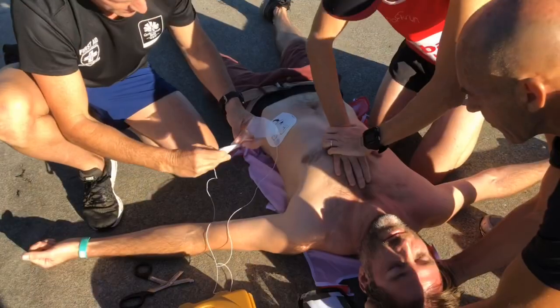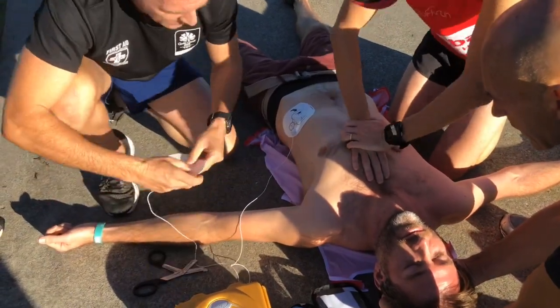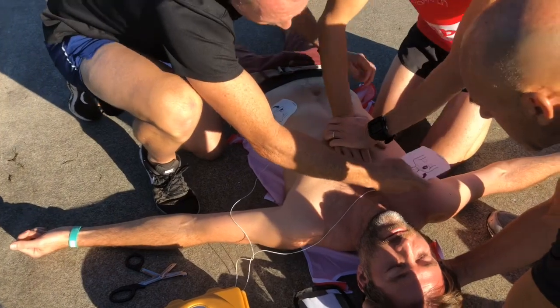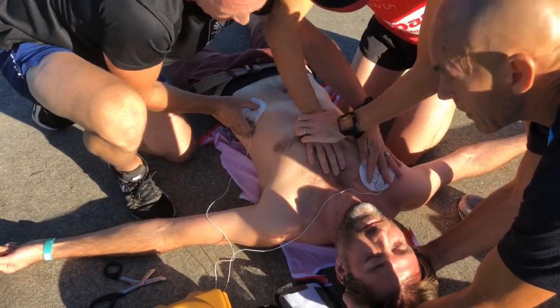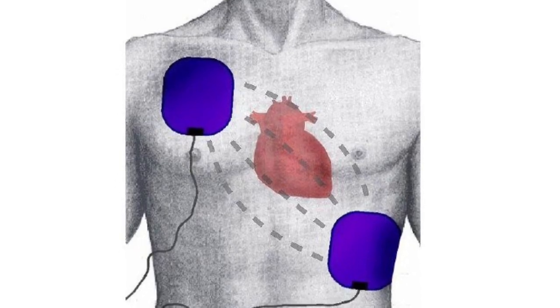Place the defibrillator pads on the patient's chest in the driver's seat belt position — one pad on the top right-hand side of the chest and the other on the bottom left-hand side under the left nipple.